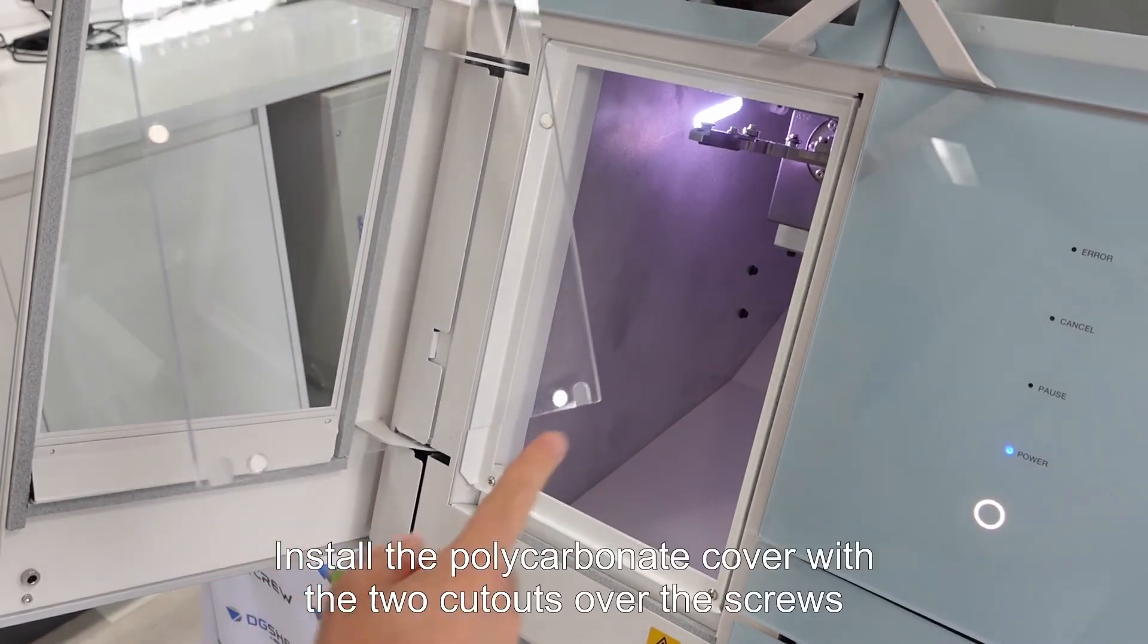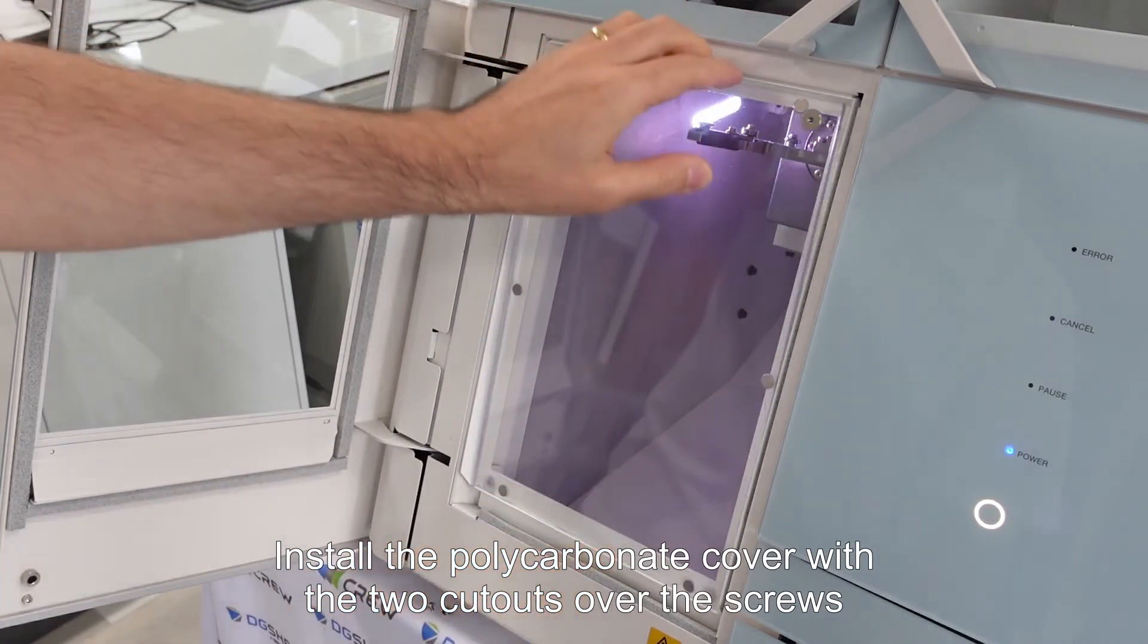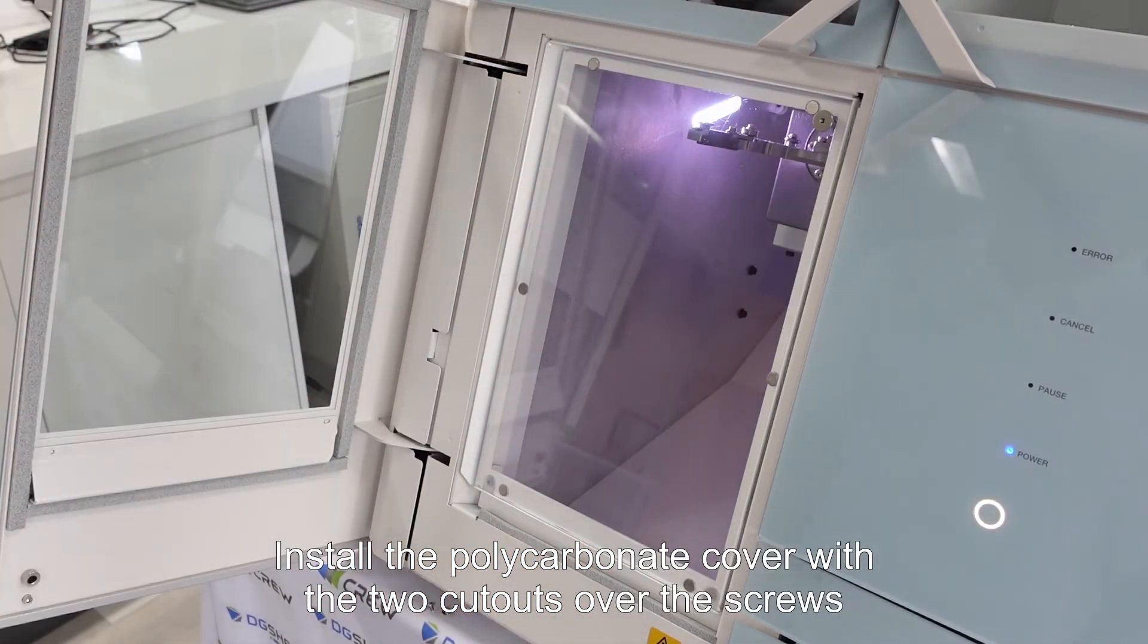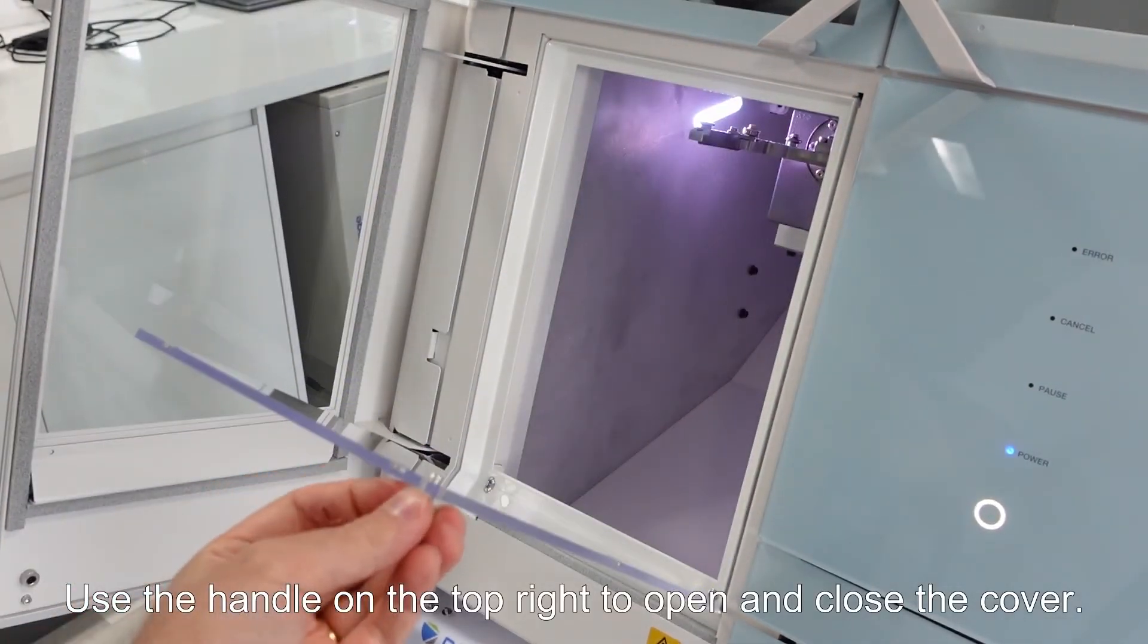Install the polycarbonate cover with the two cutouts over the screws. Use the handle on the top right to open and close the cover.